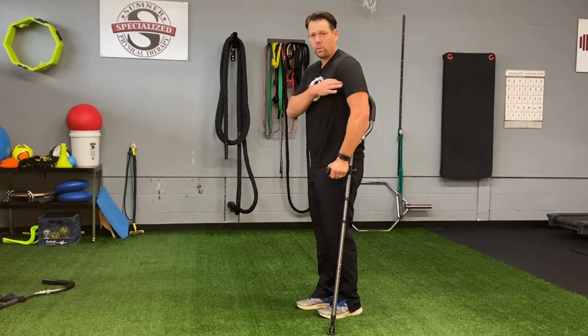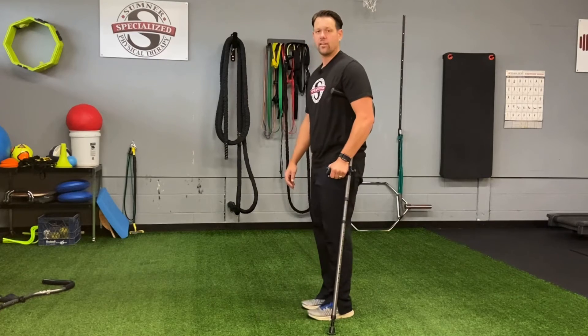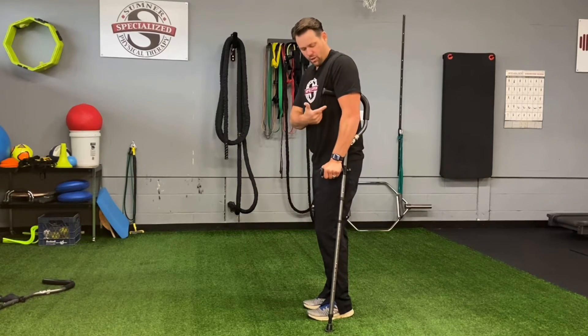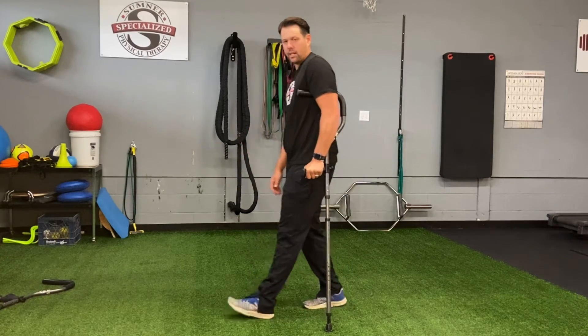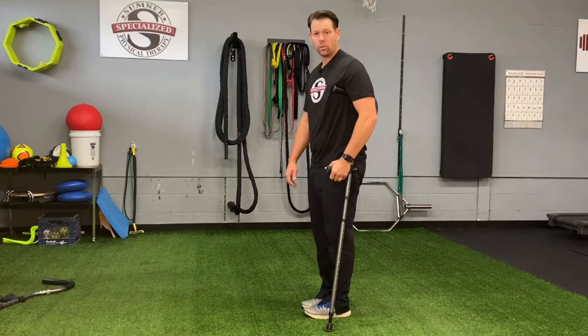We should not be resting the crutch up in the armpit as we walk. That again leads to Saturday night palsy and those types of nerve-related injuries into the armpit. What we want to do is use that arm to pinch the crutch in while my tricep does the work of lifting me as I go through. So this is how to properly fit for a crutch.